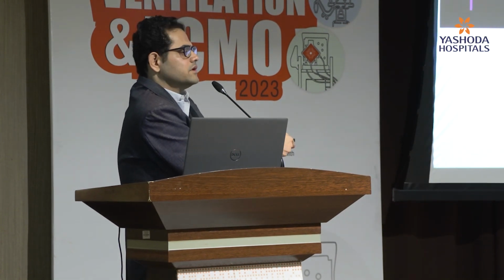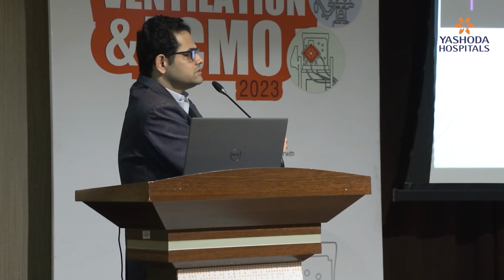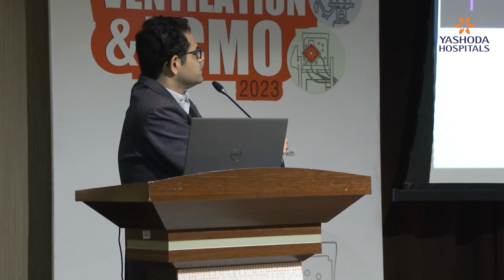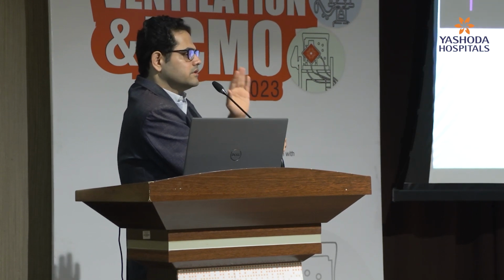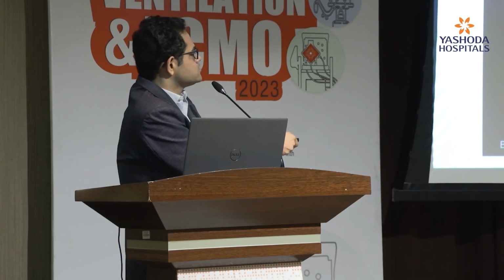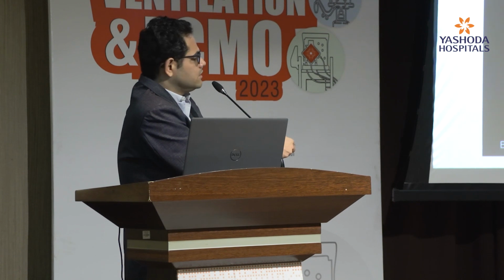This air trapping may also be seen in the flow time graphics. So these will all be further discussed in the workstation, and you don't need to worry. You can interact one-to-one during the workstation also. Again, there is a scooped out expiratory graph, usually in a COPD patient or a patient having increased airway resistance. Just give bronchodilator therapy.